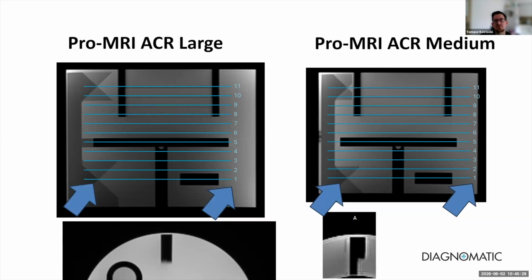The ACR protocol uses 11 axial slices. These slices should be positioned carefully using the centers of the slice locations and not the slice outlines. This is a common mistake, so remember to check that. Correct slice positioning is important because different quality control tests are performed on specific slices. If the slices are shifted or tilted, the measurement might fail even if the scanner itself is working correctly.